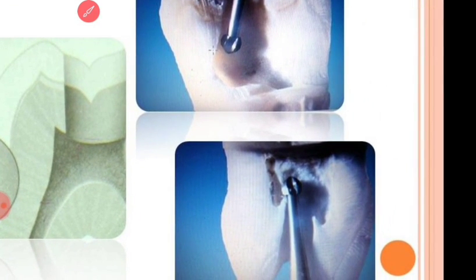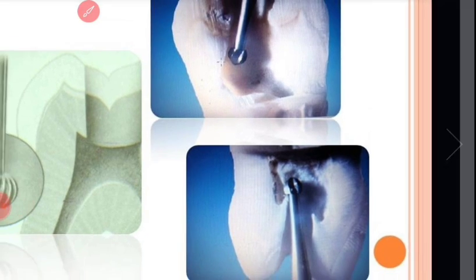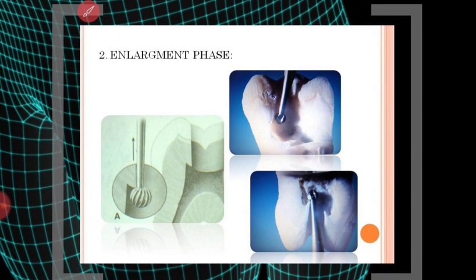All right. So there is a clinical tip I would like to share at this particular point. Sometimes the patient would have severe pain, even in irreversible pulpitis cases, and the tooth wouldn't be numb. You just pick up a new carbide burr and don't rub your diamonds on the dentine. It produces heat, it just burnishes the dentine, and the patient is way more uncomfortable. Use a fresh carbide burr, just remove the dentine, and within 5-6 strokes you will find an opening of a pulp horn or the pulp chamber.